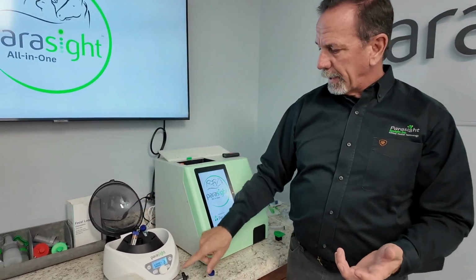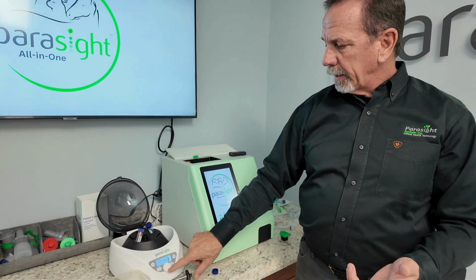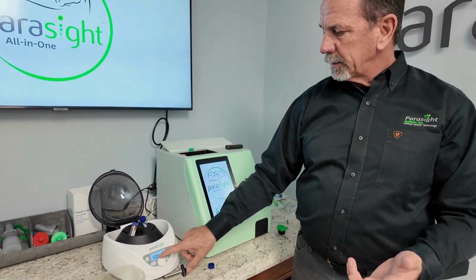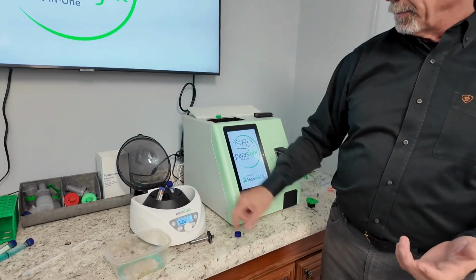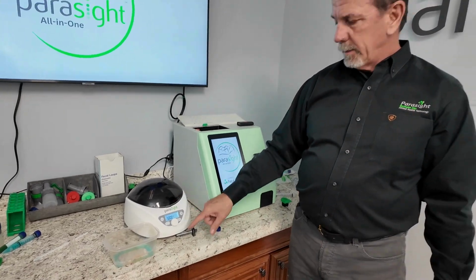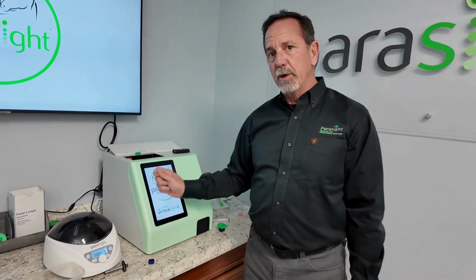We'll go ahead and put that back in here. We're going to go ahead and change this back to 1 minute. So we'll change that to 1 minute. We'll go ahead and close that. We'll run that, and then we'll continue the test like we normally would.